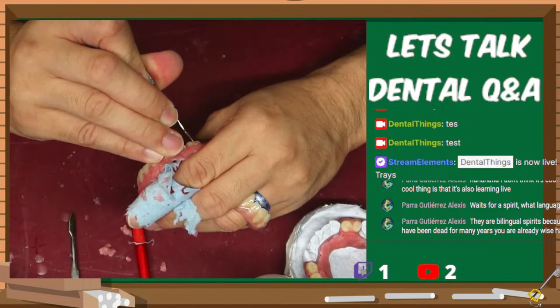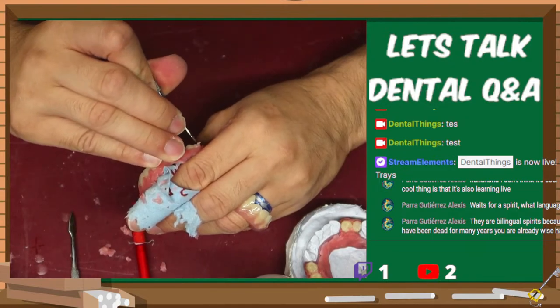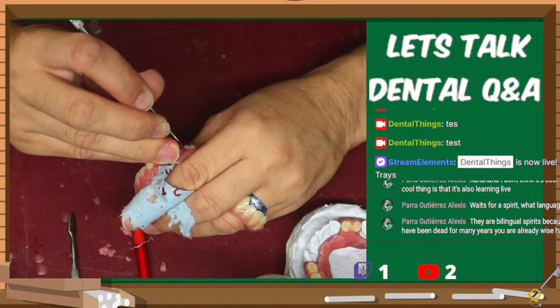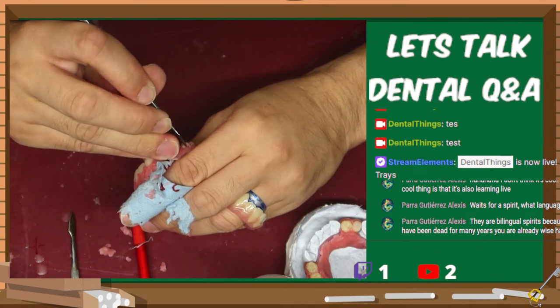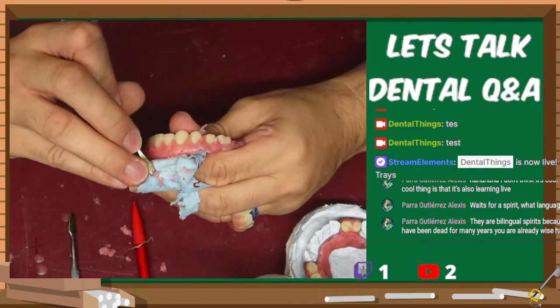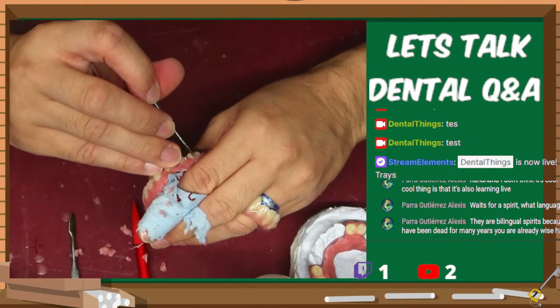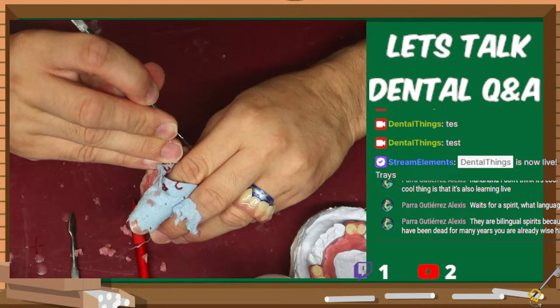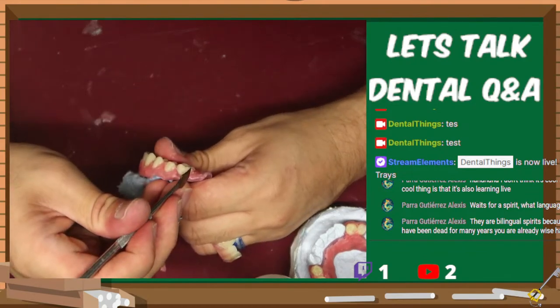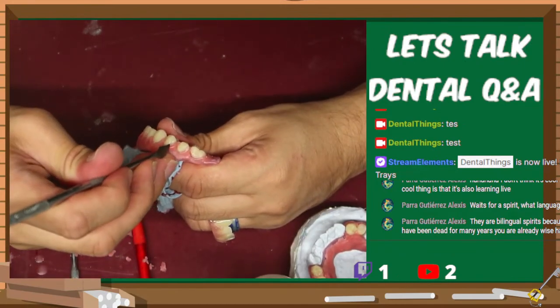And then let's clean out some more off of this molar. Let's raise the gum line a little bit more. I think if I remember right, I had to cut down a lot of the neck of the tooth on this one to make it fit in this arch. So that might not be something I can super creep up on this tooth to show the cervical or the neckline of it. I can go and feather here, or taper, you can use that word.